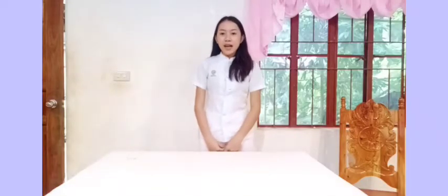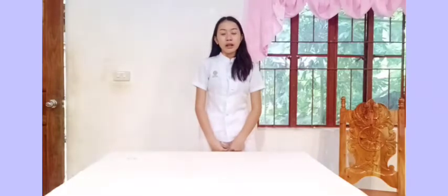Good day, I am Mercy Antinabro Icat, a second-year nursing student from GHCVS State College, Pagadian Campus, and I am going to perform the thermometer technique for today.